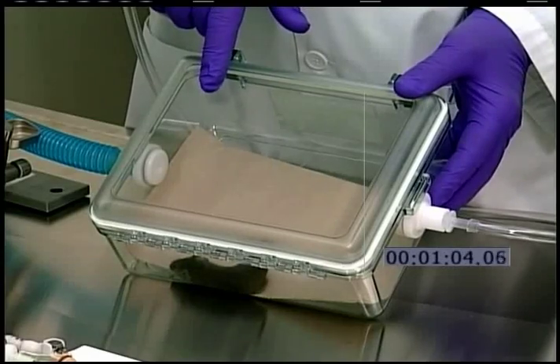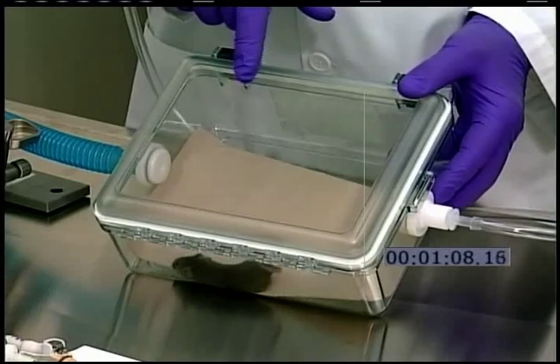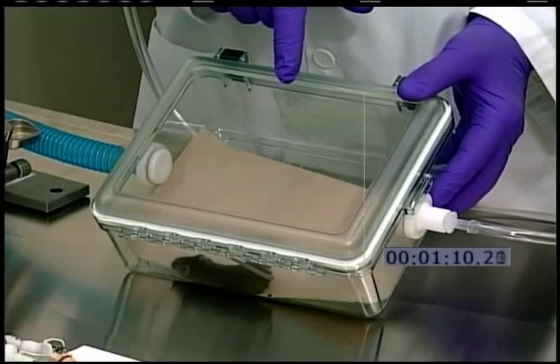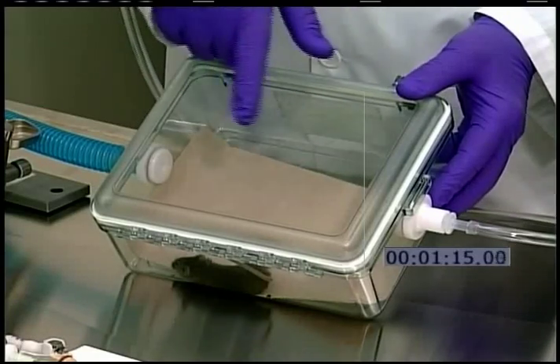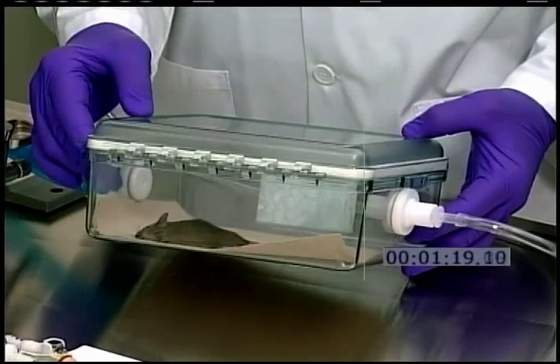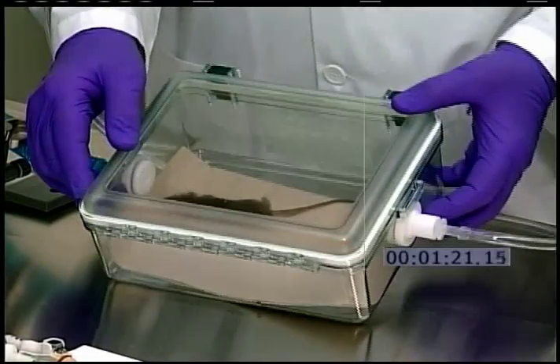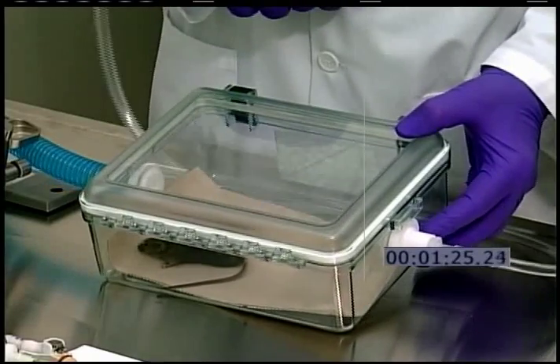His eyes are opening, his ears are moving. He is starting to become recumbent. See his tail wiggling now? I said recumbent and I meant he's starting to become active, excuse me. His tail's wiggling, and if I were to agitate him just a little bit, we just might see that he would try to stand up or try to right himself, which he has done right now.